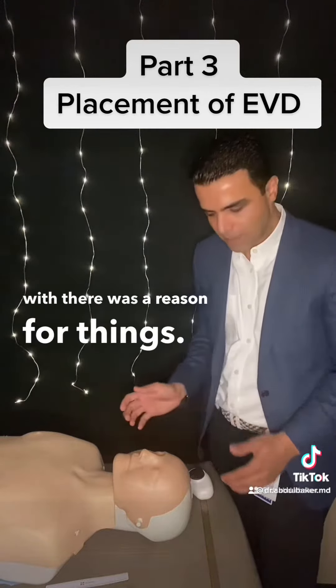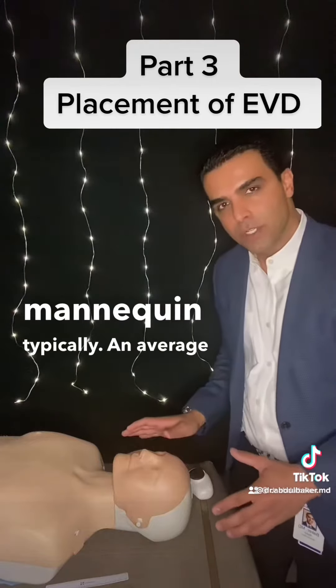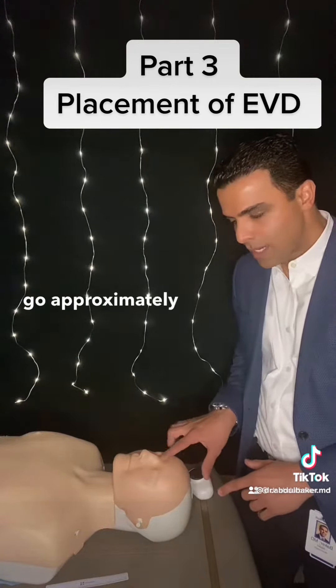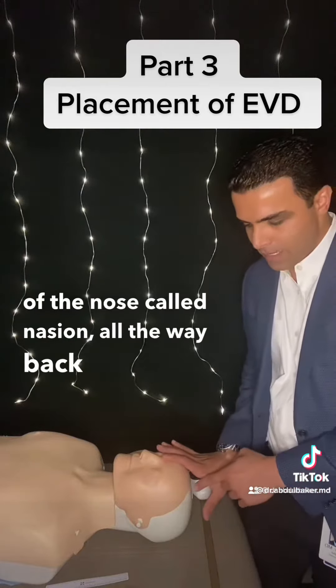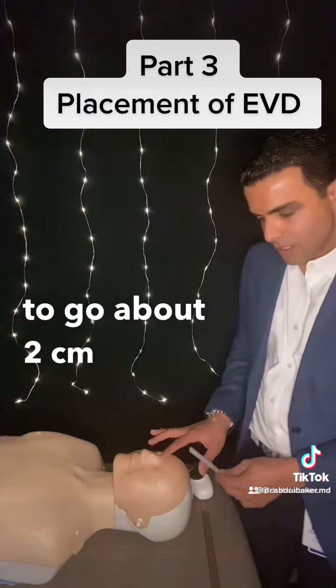There's a reason for things. So this is a mannequin. Typically, in an average adult, you want to go approximately 11 centimeters from this point — the ridge of the nose, called nasion — all the way back, and want to go about two centimeters lateral.